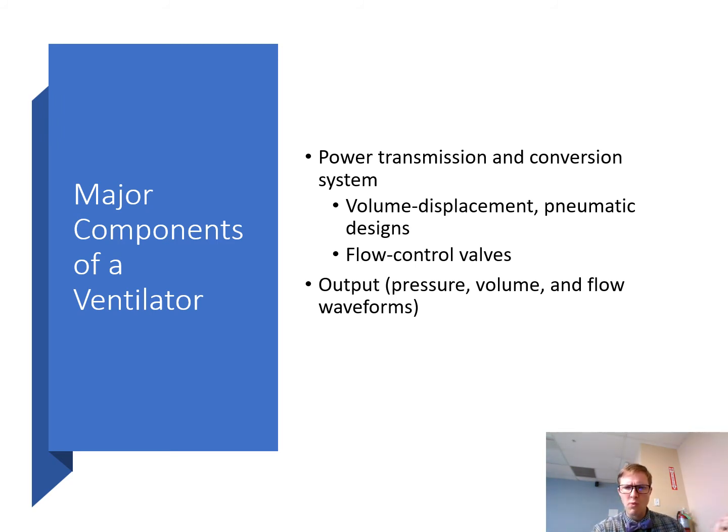So how do you get the pressure when you plug your ventilator into a wall, or when you plug your oxygen Thorpe tube into a wall? Well, the hospital uses large piston water-cooled compressors to supply pressure to the gas outlets. So many ventilators use that pressure from the wall outlet as a power source.